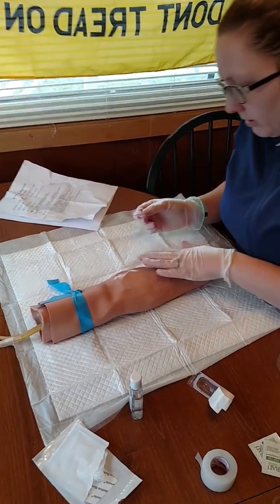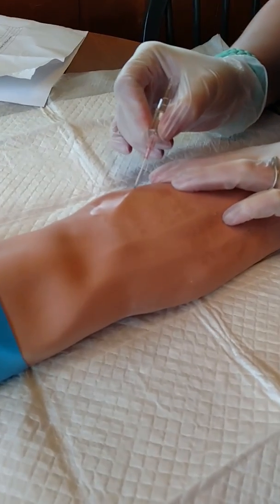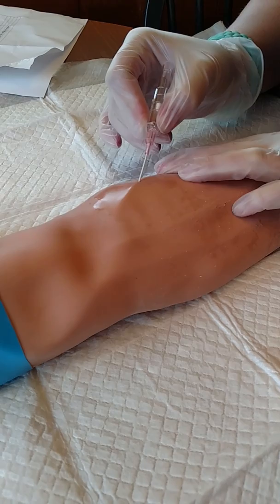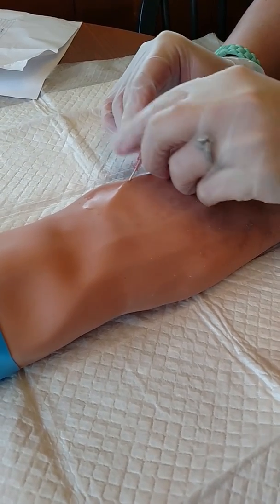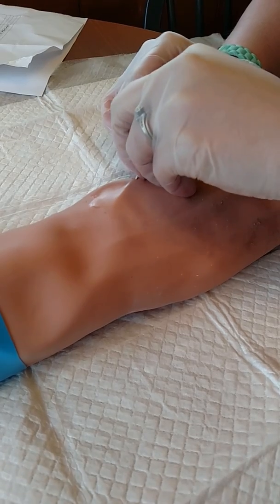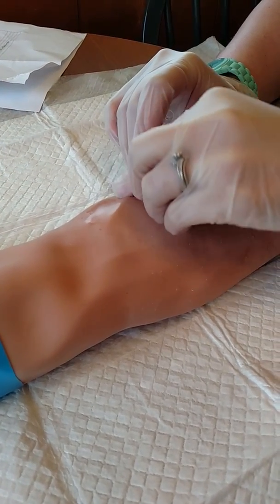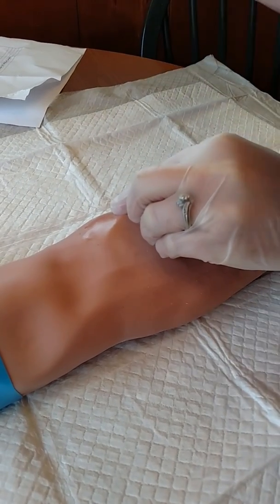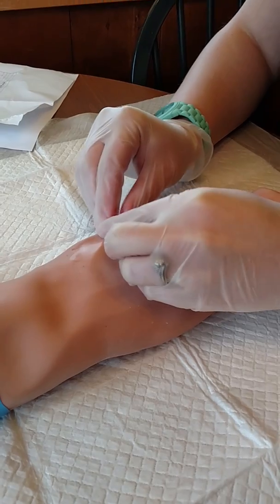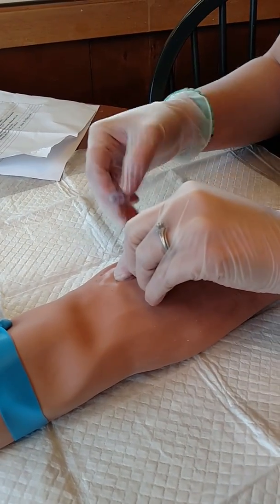Alright, and I would raise the bed at this point. I'm just going to sit down here so I'm at a good working level. Alright, here we go. Pull down on the vein here and insert. Little poke, and we're in. Going just a little further. And flick it in. Hold down. That goes in the sharps here. Hold a little bit of pressure at the end while we get this inserted.